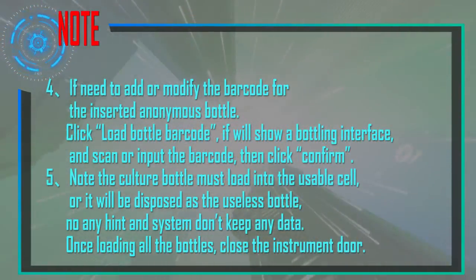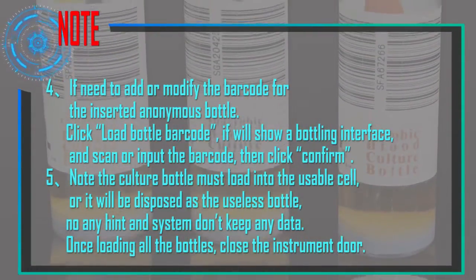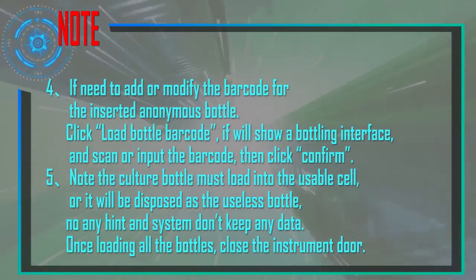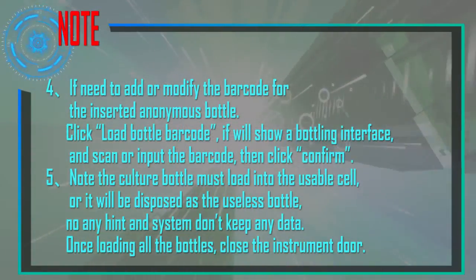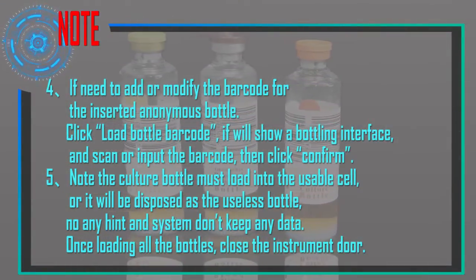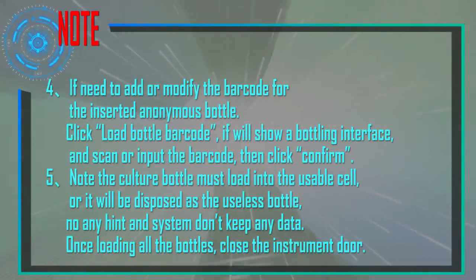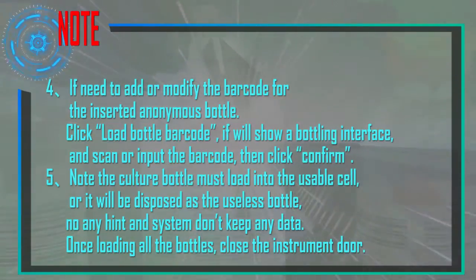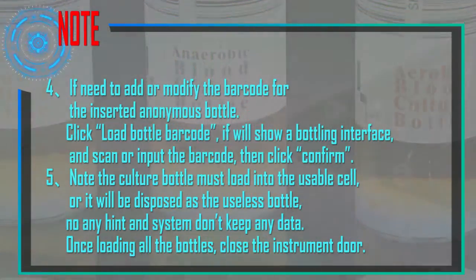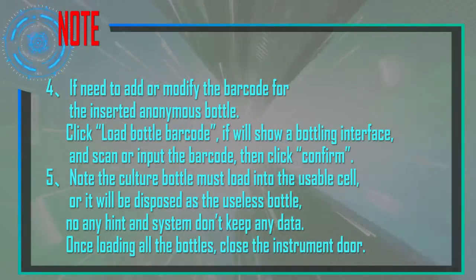If you need to add or modify the barcode for an inserted anonymous bottle, click Load Bottle Barcode. A bottling interface will appear — scan or input the barcode and click Confirm. Note: the culture bottle must be loaded into an available cell, or it will be treated as a useless bottle with no hint and no data kept by the system. Once all bottles are loaded, close the instrument door.